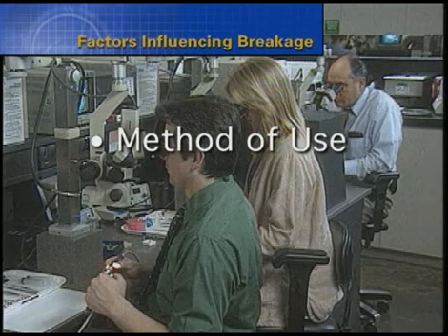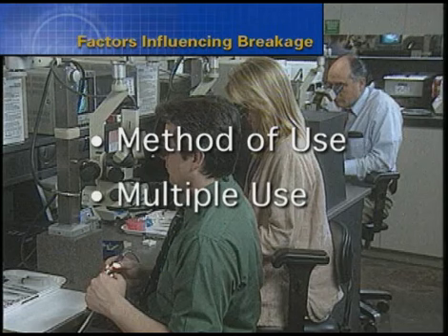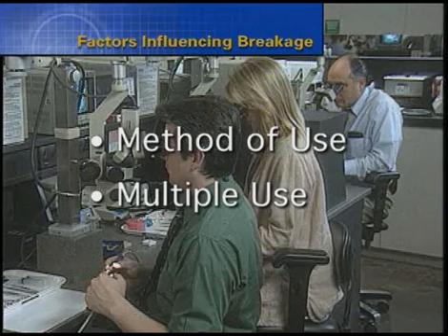The second cause would be multiple use. In my opinion, an instrument should be discarded after a single case for a variety of reasons, such as metal fatigue, loss of cutting efficiency, and the great variations in length, diameter, and curvatures of canals. In general, if your method of use is appropriate and you discard files after a single case, you should stay out of trouble. However, if you do get into trouble, let's take a look at those factors influencing removal.